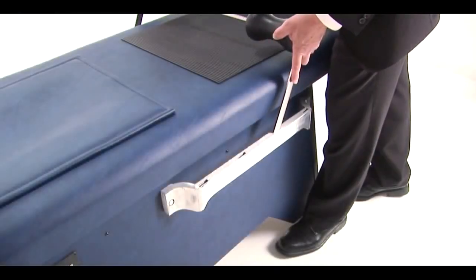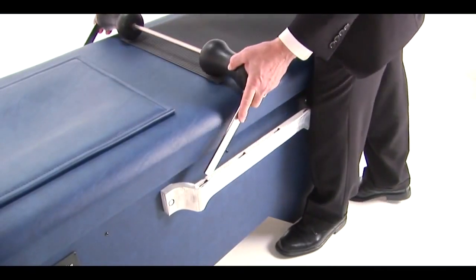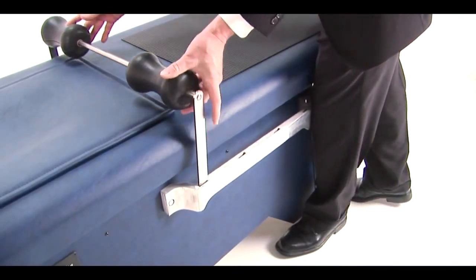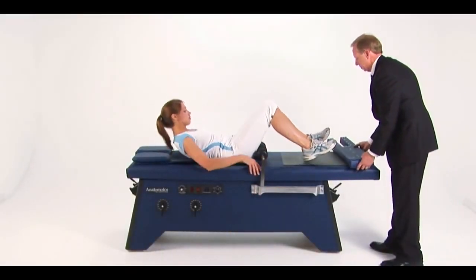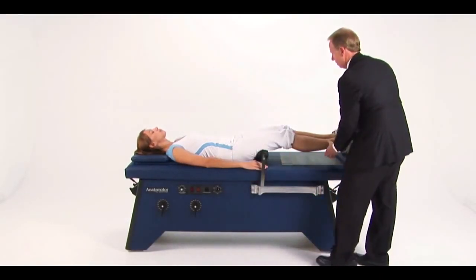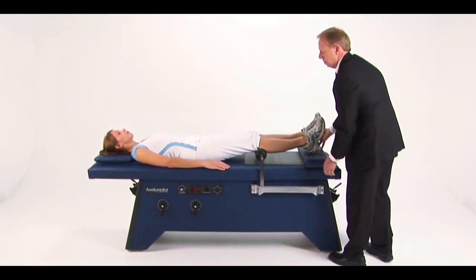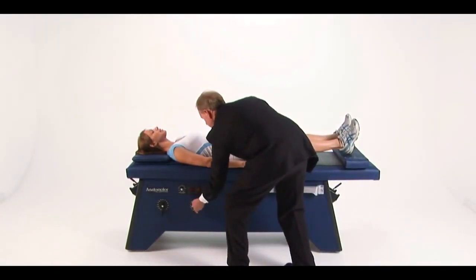The leg rollers are designed to massage any area of the legs and can be used simultaneously with the back rollers. The leg roller bar easily inserts into any one of the 4 different positions. Placement of the rollers may vary with the patient's height and the area to be massaged. For hamstrings and lower buttocks, insert the roller bar in the slot nearest the center of the table. To massage from just below the knees to the ankle area, normally the bar would be placed in the second slot up from the foot of the table.